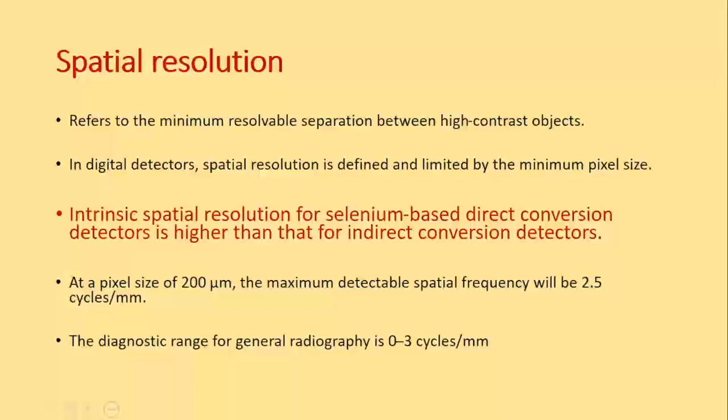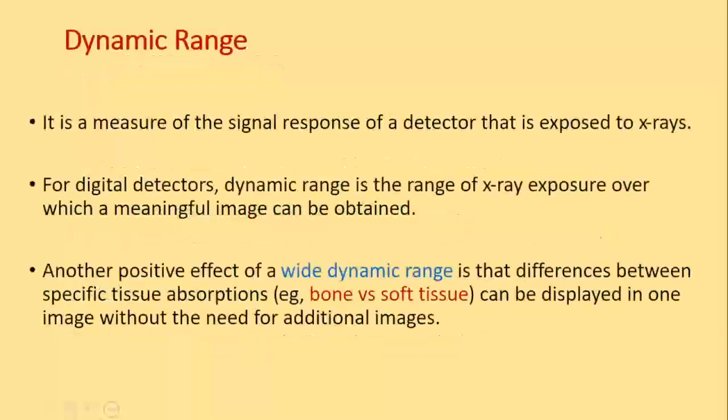So to match with that kind of spatial resolution, CBCT does great. If you look at 3D, you will not use terms like line pairs per mm, but on a conversion scale, you change that to cycles per mm, and most of the diagnostic range is roughly 0 to 3 cycles. Forget these numbers, but just to let you know, the CBCT resolution is pretty good to see a lot of things. Then we looked at dynamic range, showing right from bone to soft tissue, that we understood.